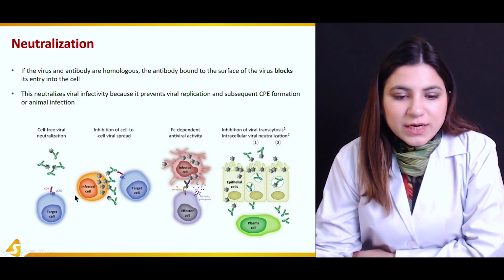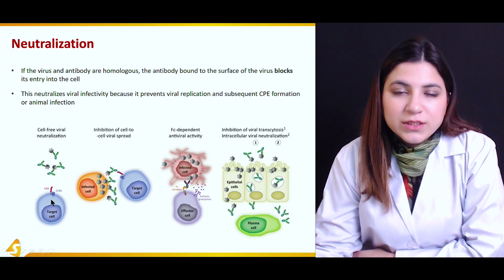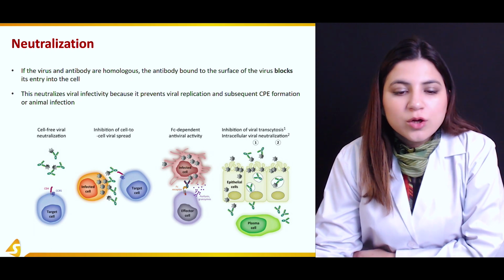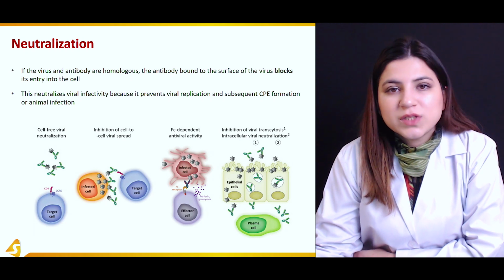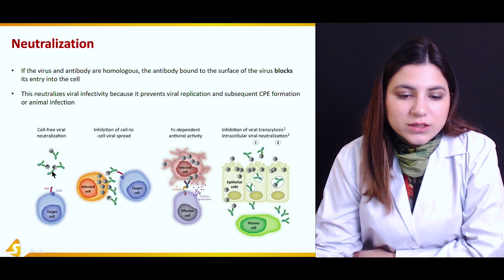So you can see that the antibodies are basically bound to the viruses, and thus the virus is not able to enter the target cell. And since it's not able to enter the target cell, it cannot cause infection or any type of cytopathic effect that can be visualized. So it means that the antibodies are basically neutralizing the virus.